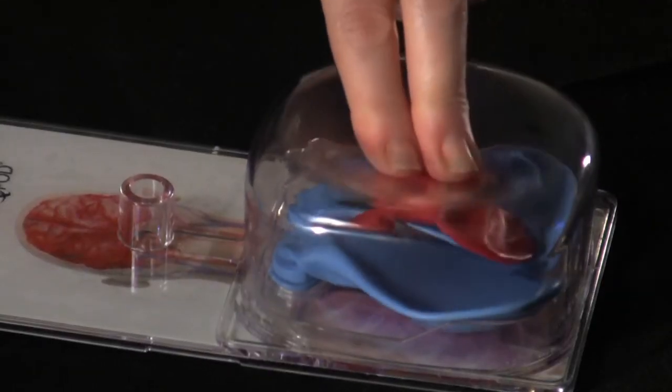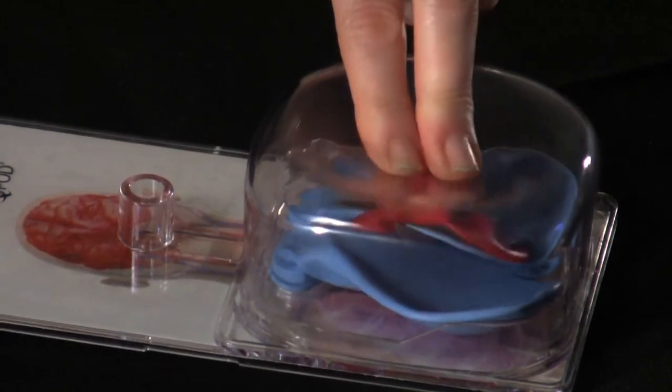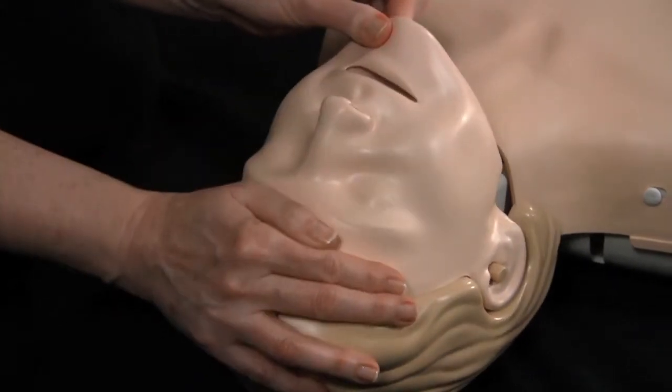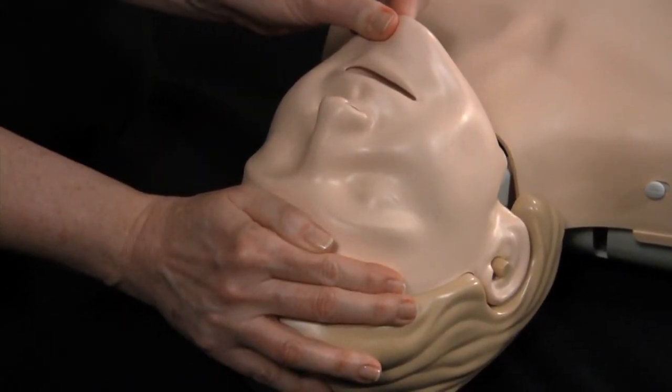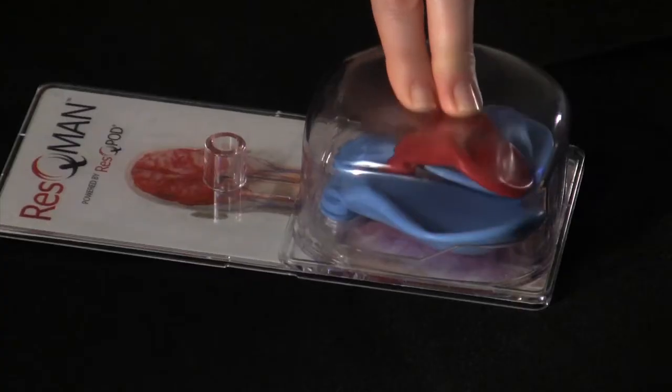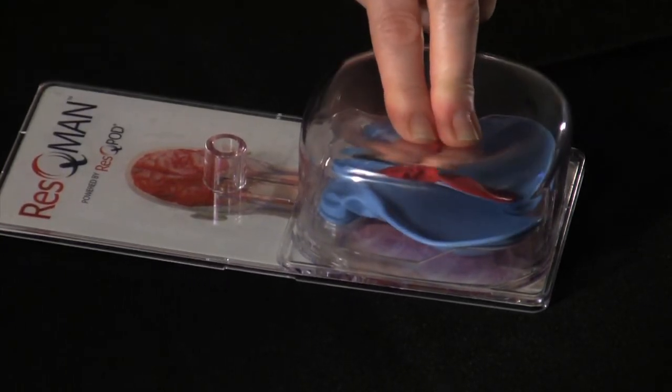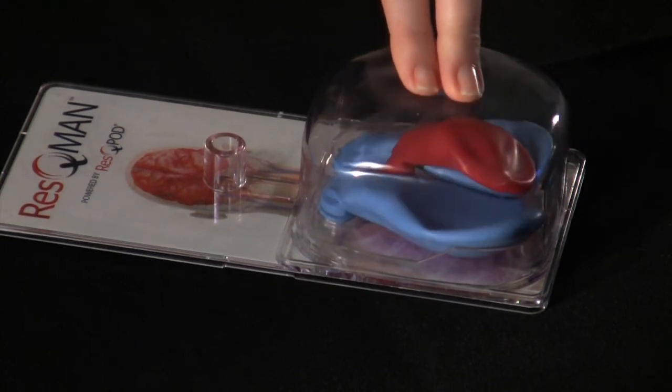As we can see here, the heart is not completely filling. One of the primary reasons blood flow is limited is because the patient's airway is open. This wipes out the vacuum we're relying on to fill the heart. Notice how the heart stops filling as soon as the air comes in.